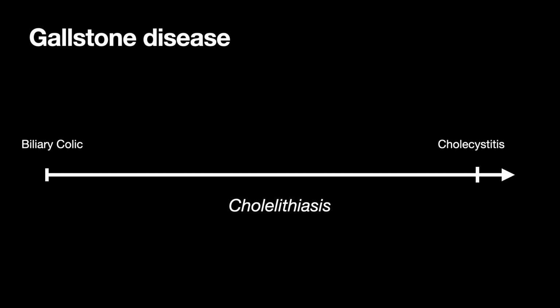And so just understand that this is a spectrum of things that we're going to see in our patients clinically, and we're going to have to interpret what we see clinically with what we see sonographically, and then make some decisions about how we're going to get our surgeons involved and what next steps are going to need to take place for these patients. So with that background in mind, let's switch gears and talk a little bit about the ultrasound side of things, because that's really what we're here for.